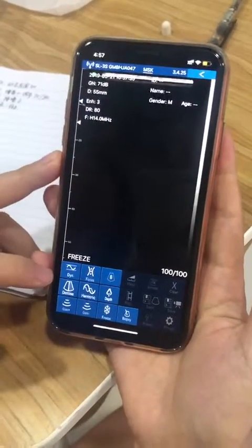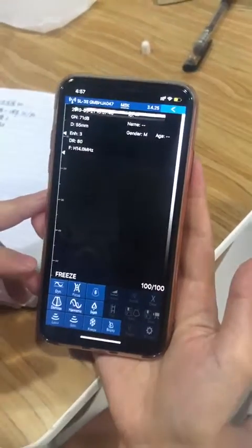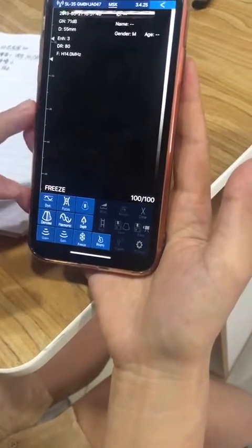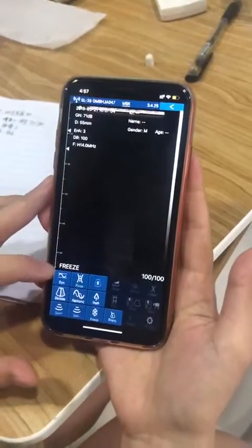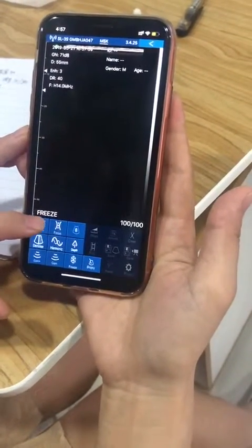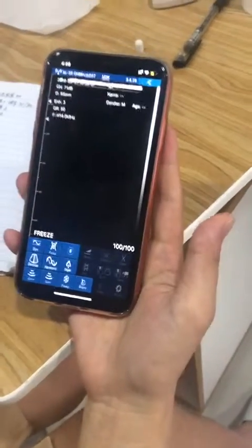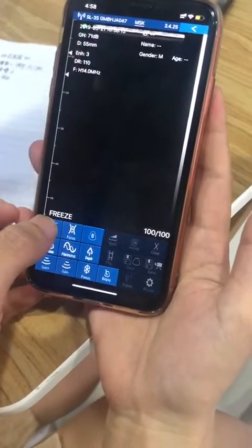Okay, and the DR — we will adjust it to 40 DR here. Dynamic, yeah, still press, it should be 40, 40. Where is it? Press, press, yeah, press, okay. Now 50 is too much — wait, wait — 40, 40. Okay, it's okay.